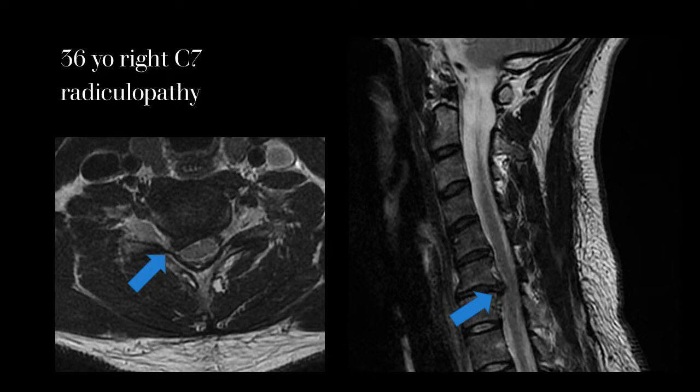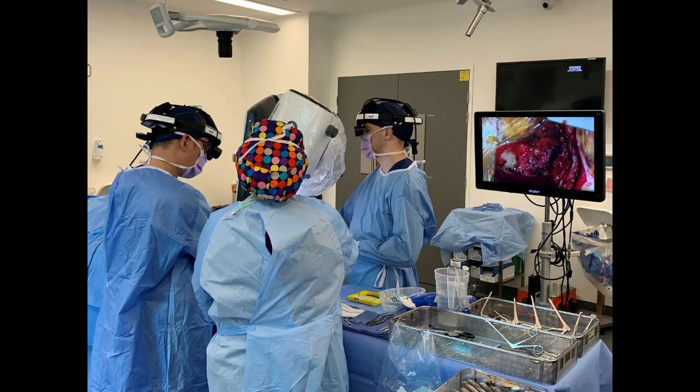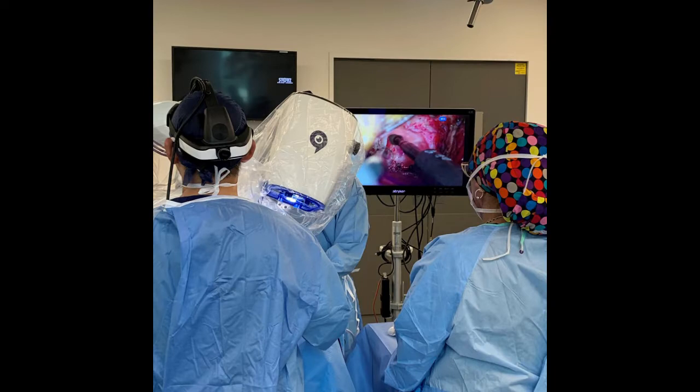This is a 36-year-old man with a right C7 radiculopathy from a C6-7 disc herniation. The patient was positioned prone in Mayfield pins and we used the robotic scope for the entirety of this case.